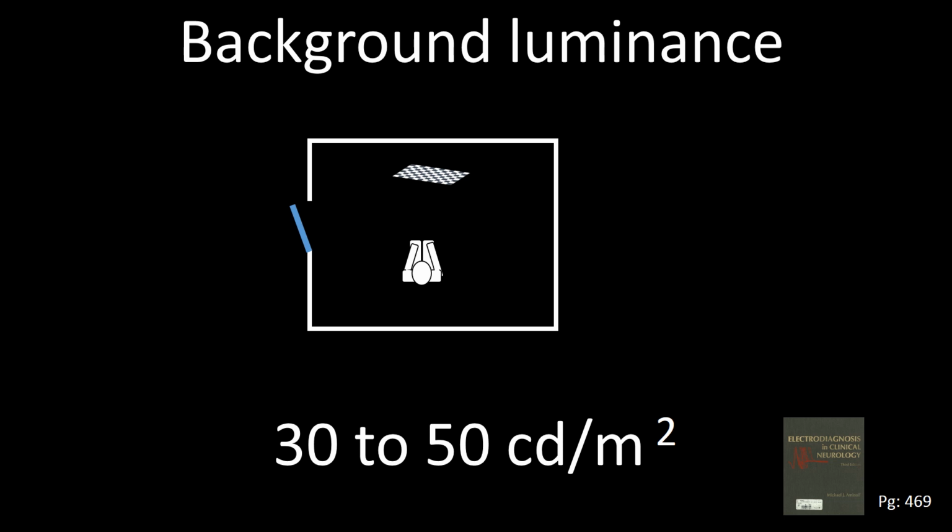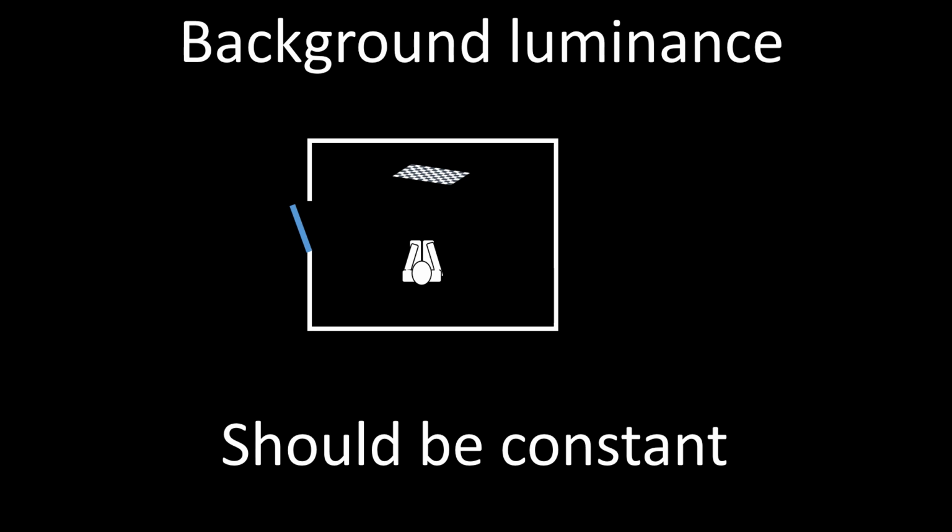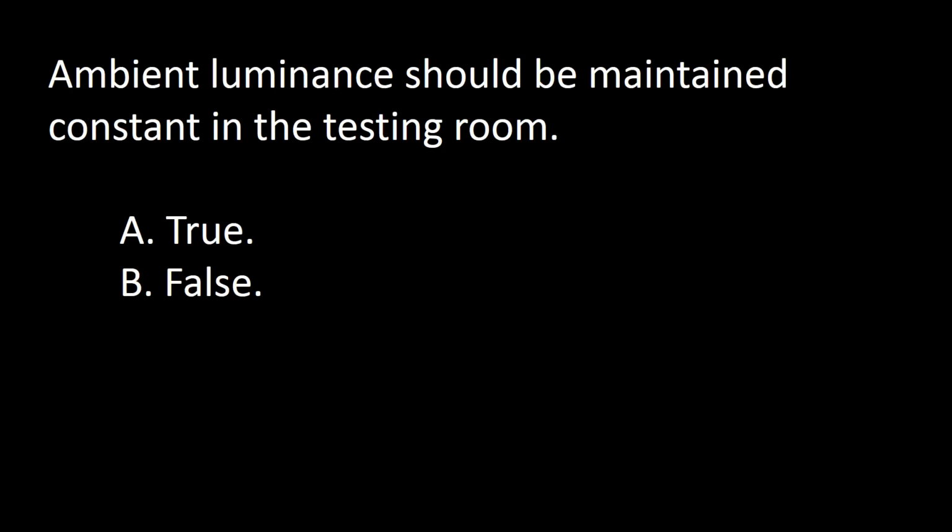Aminoff's book states that background luminance should be 30 to 50 candelas per meter square. Despite the different numbers given by different authors, as you just heard, all agree that the background luminance should be kept constant. So the answer to this question is A.